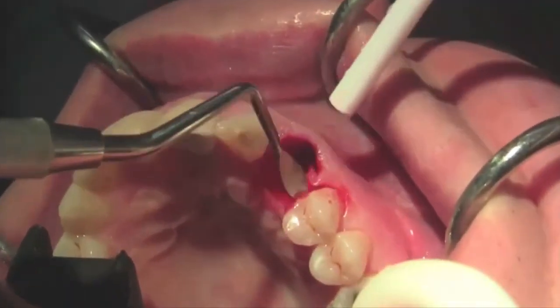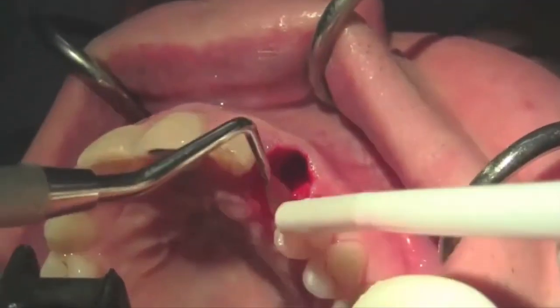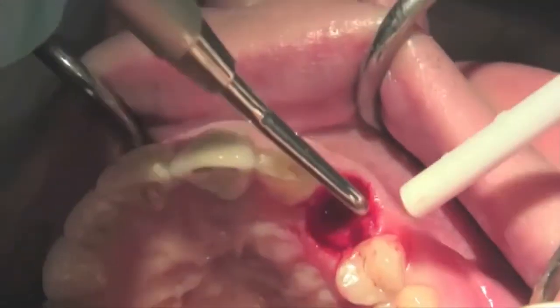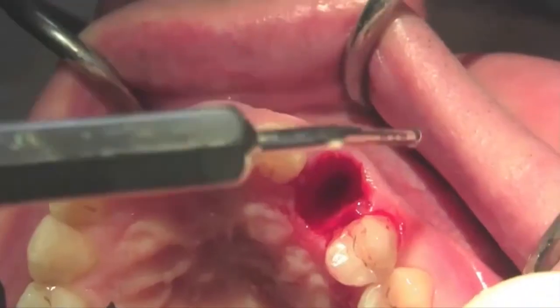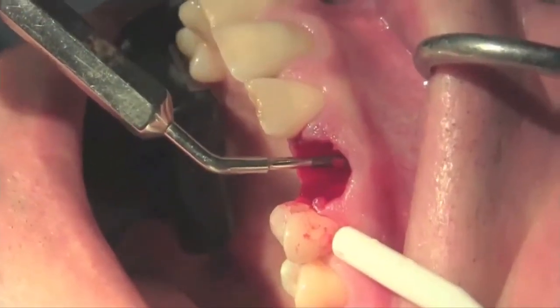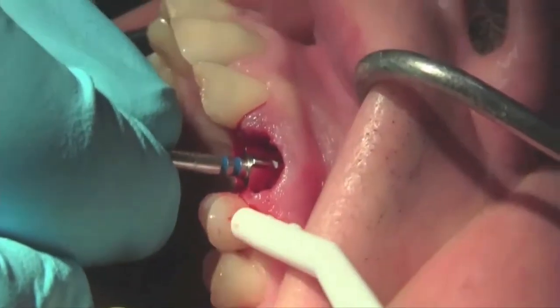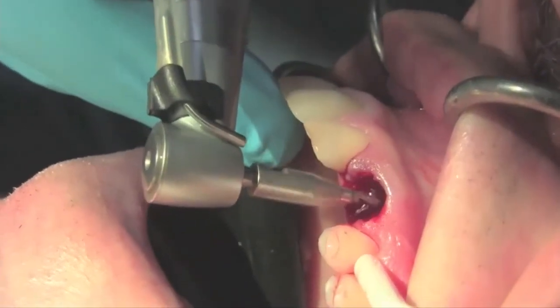We proceed to remove any granulation tissue, soft tissues in the area, and any infected tissue. It's very important to irrigate with saline solution as we are doing the curettage, and to take the appropriate measurements of the socket, from the most coronal part of the tissue all the way to the most coronal reference of the bone tables.